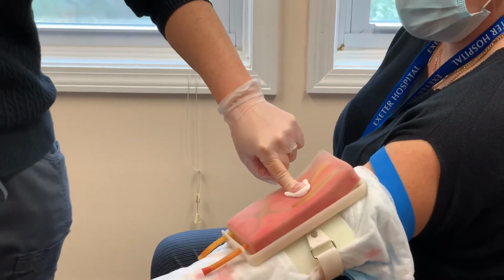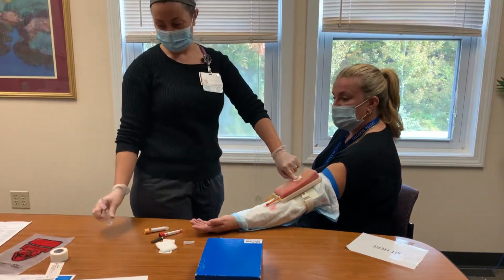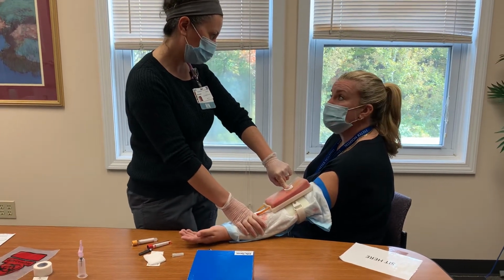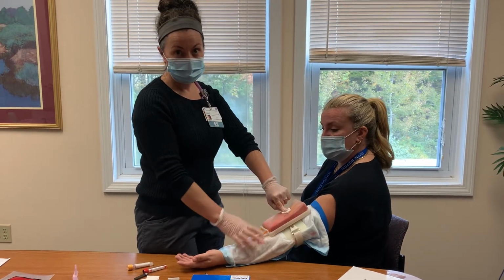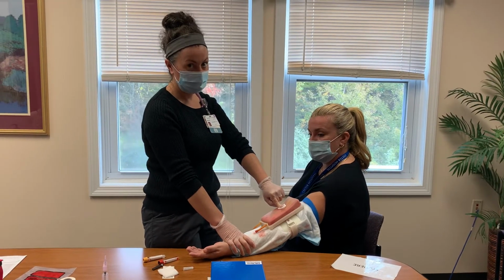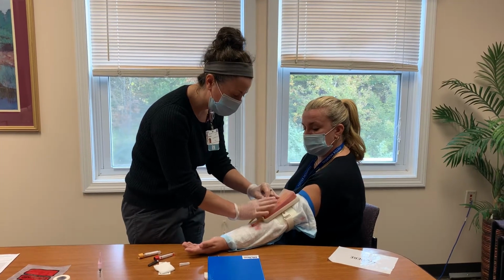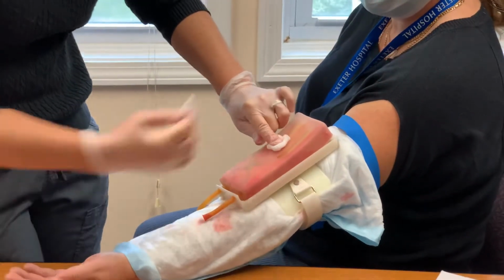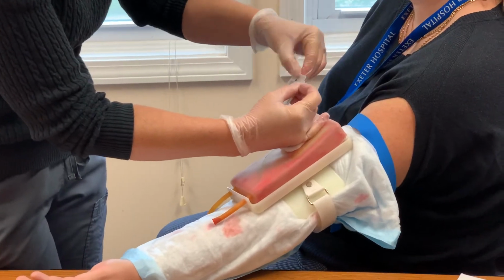Okay, and then with the safety, I'm going to use the table to execute the safety. We're not using that on the patient, obviously. I'm going to apply pressure. Are you on any blood thinners or anticoagulants? No. Okay. You want to be the one putting the pressure. Ultimately, you're responsible for the site. I would say at least 30 seconds to a minute. I'm going to have a look. Any bleeding, any hematoma, bruising forming, site looks good. Okay. You can put tape or a little band-aid, that's fine.